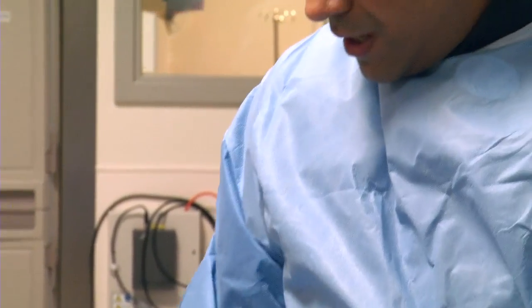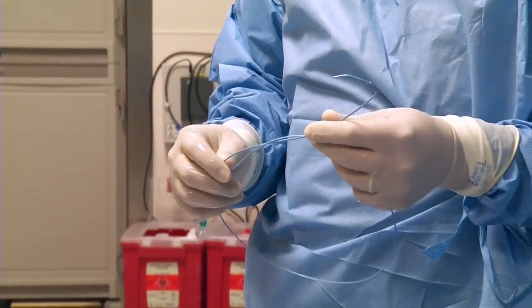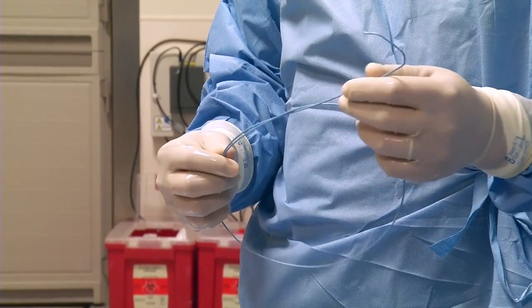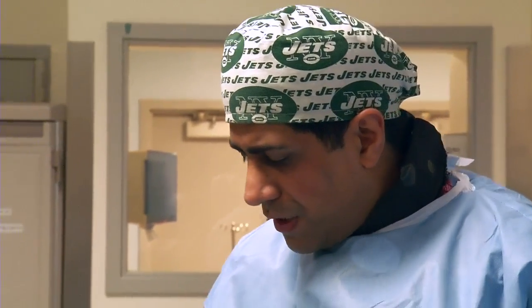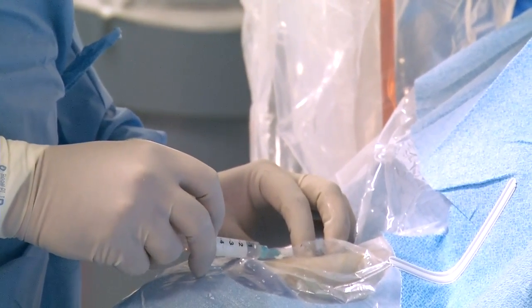Now the catheter, we also have a specialized catheter for the radial. This is called the Jackie catheter, and this is a universal catheter which can engage both the right coronary artery and the left coronary artery. And it does have a side hole on it, so you can do an LV gram as well with this catheter. So it definitely increases the speed of the procedure, that you're able to use one catheter to do all three. So we're just going to give a little bit of lidocaine over here at the access site.